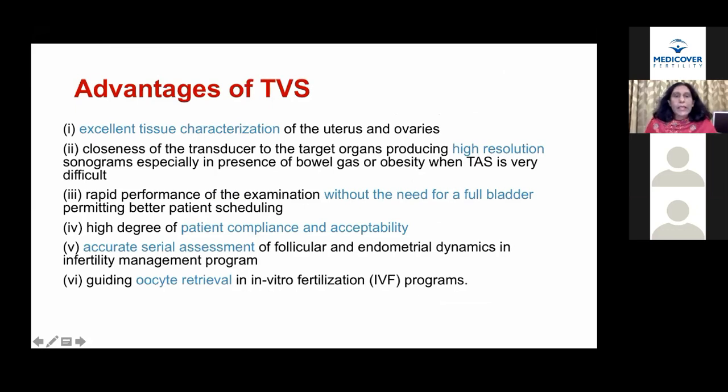The probe does not require the need for a full bladder. It gives a good comfort level for the patients. The patient compliance and acceptability is good for serial assessment of follicular and endometrial dynamics. It's also used in IVF for the egg retrieval.